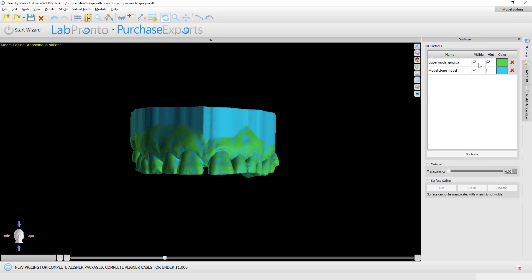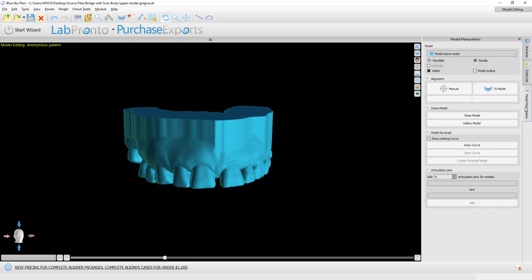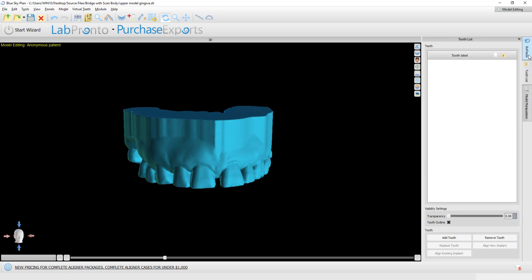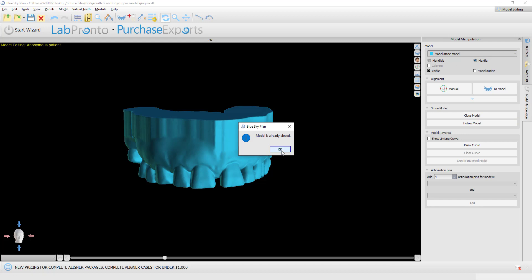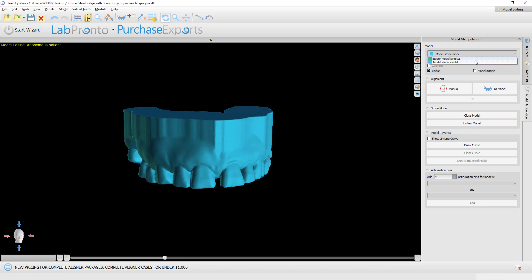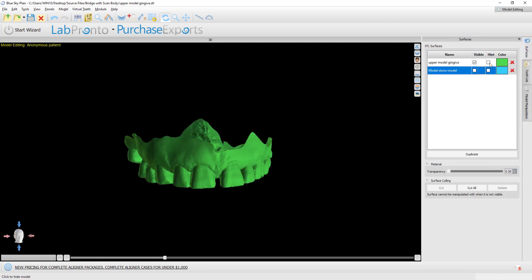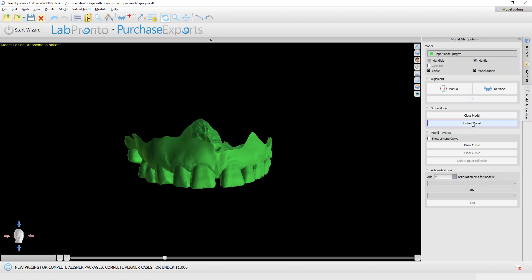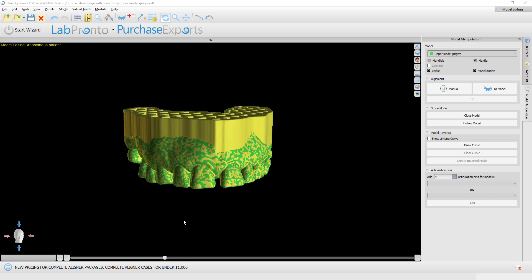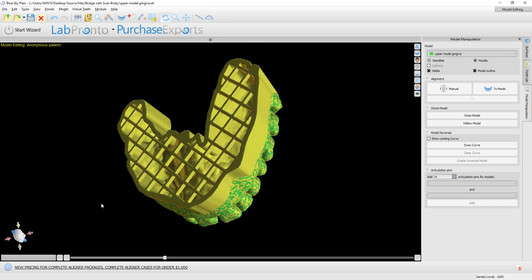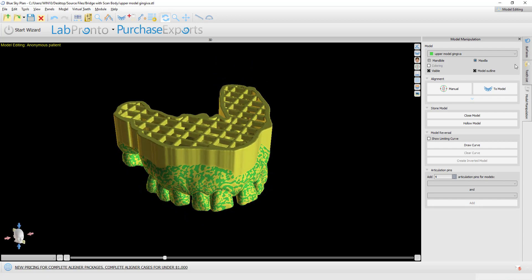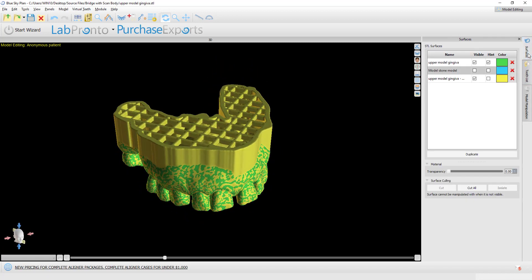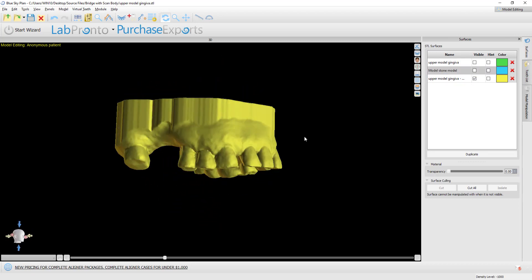We can see we have our model. If we're going to be printing it and we want to make it a hollow model to save on printing materials and printing time, we can simply make sure the model is selected and click hollow model. Or let's go back to our green model, make that visible and active, and now let's click hollow model. Even better, you don't need to close the model first, then make it hollow. You could just create a hollow model if you're going to be printing.